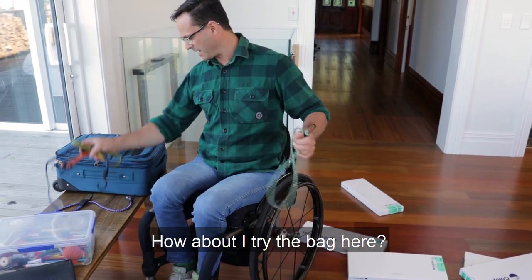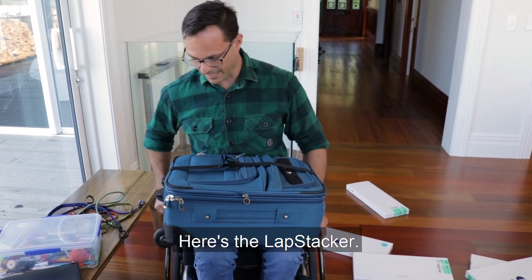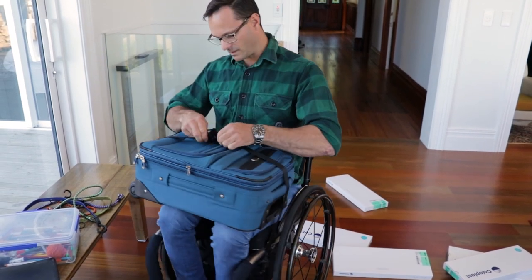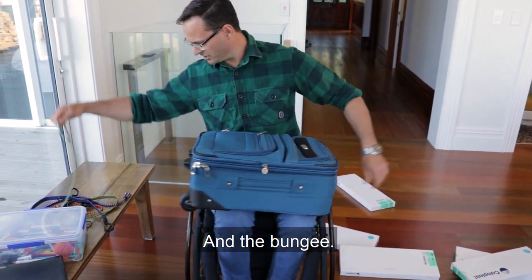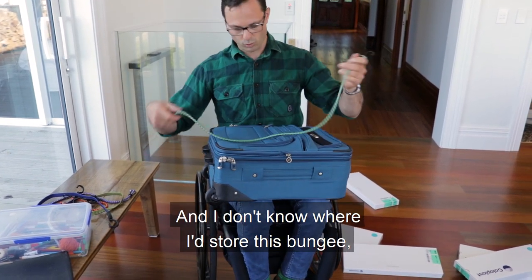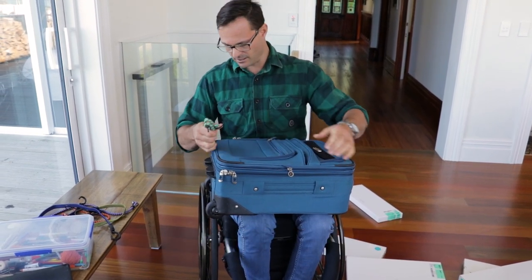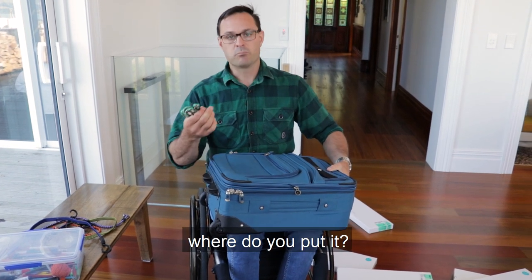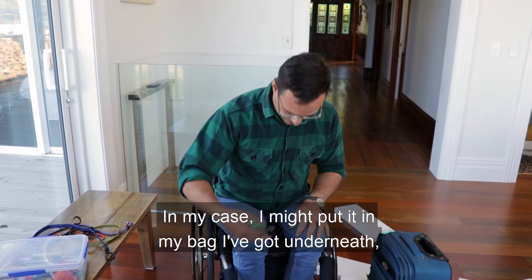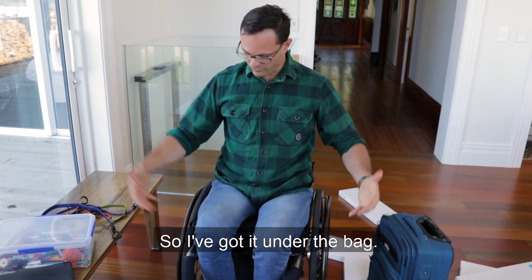How about I try the bag here — the suitcase. There's the lap stacker. Awesome. And a bungee — we'll try this long one again. And I don't know where I'd store this bungee. That's the other thing. I guess you might wrap it up, but where do you put it? That's a big issue. In my case, I might put it in my bag I've got underneath, which is fantastic. So I've got it under the bag.